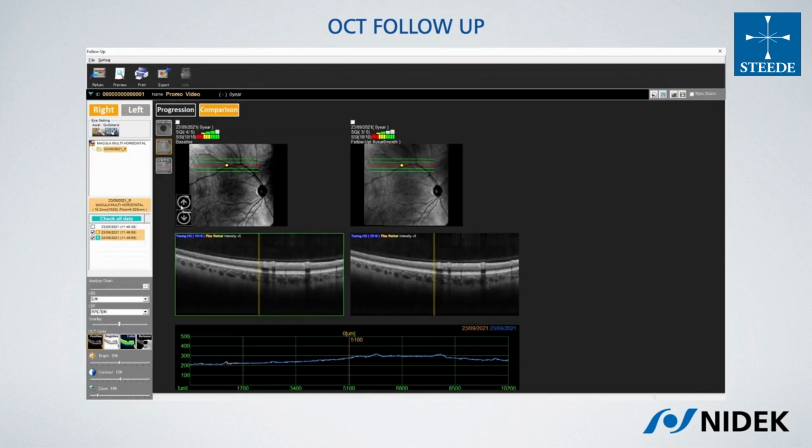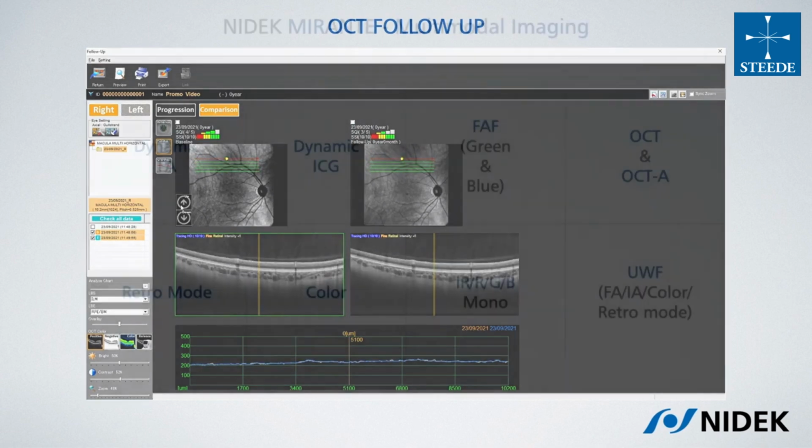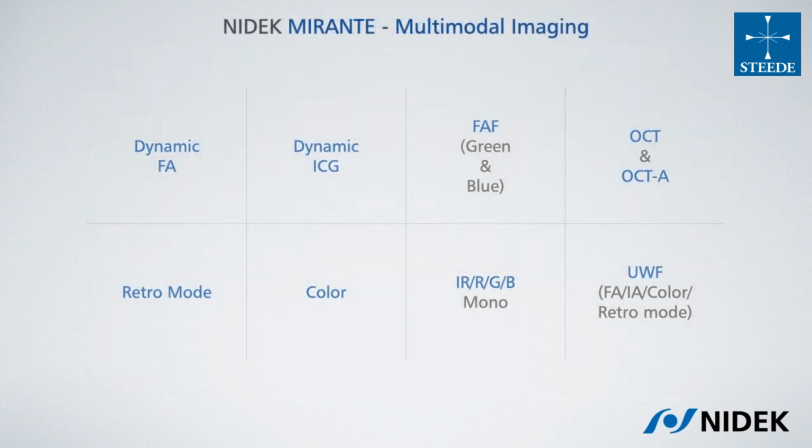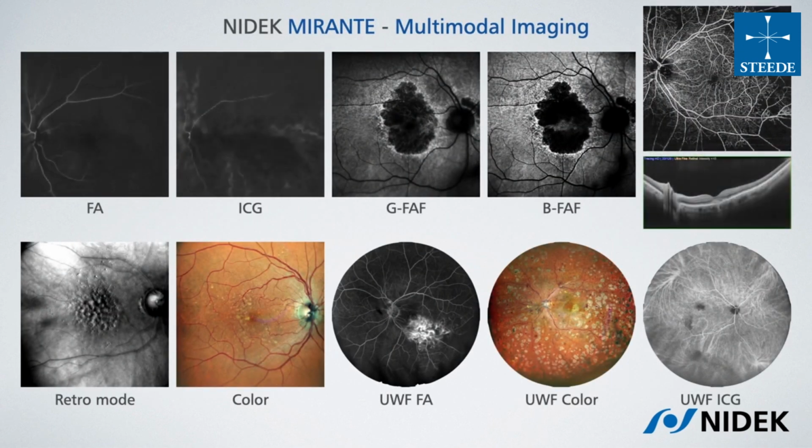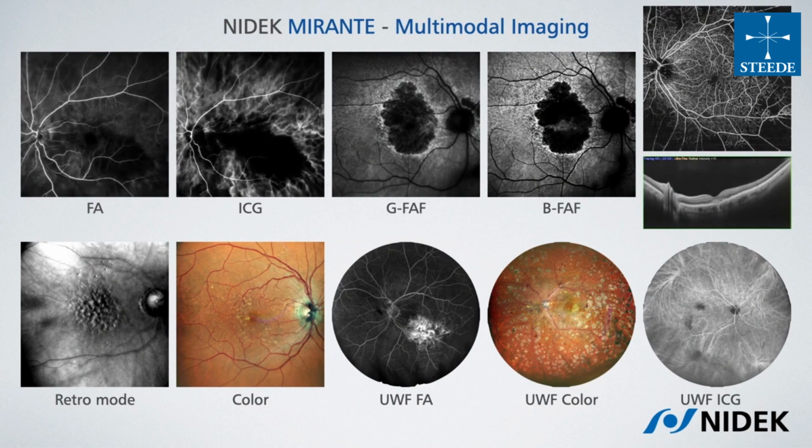It's then extremely easy to compare the baseline and the follow-up examinations one next to the other for maximum accuracy and reproducibility. So this is what you can do with the Nidek Mirante. All these modalities into one single powerful imaging platform.